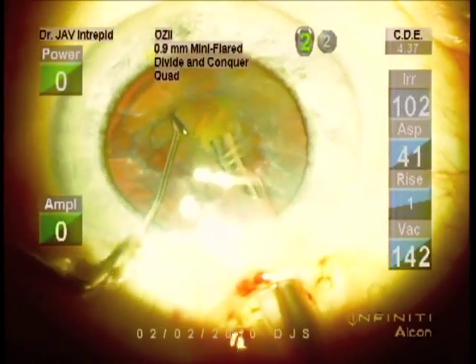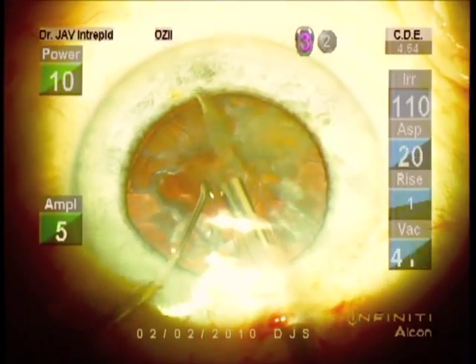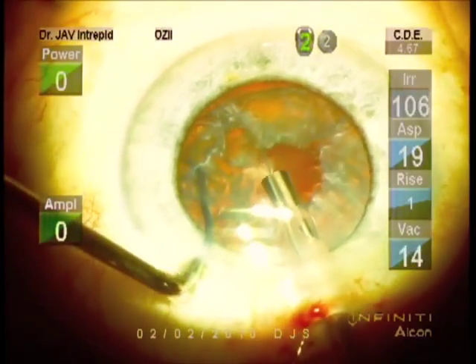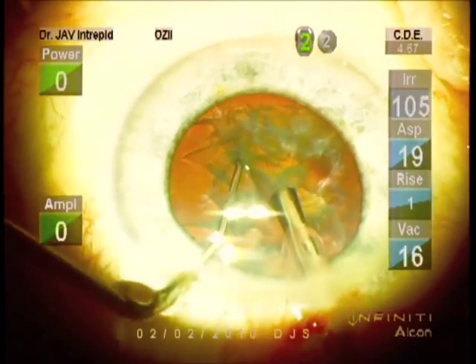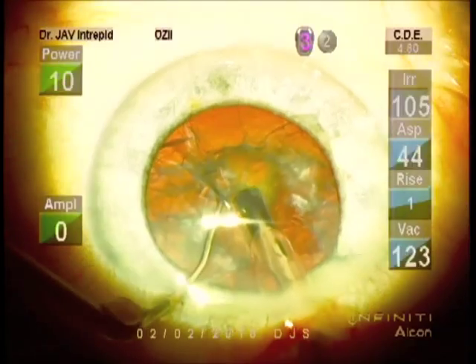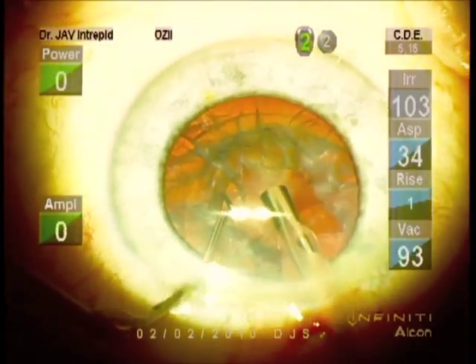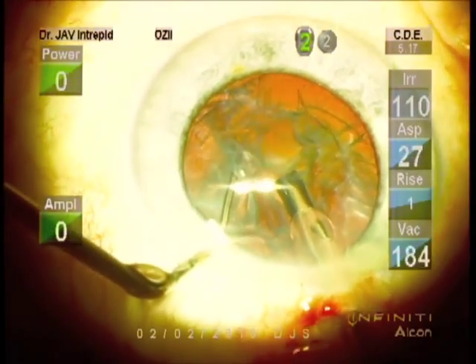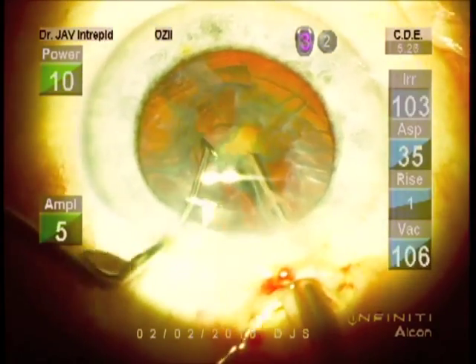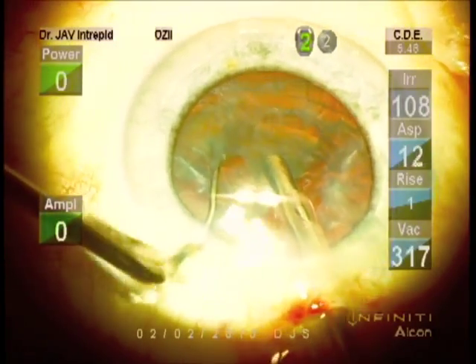If there's an available piece that looks reasonably parallel in size, draw that into the center first, and follow with any adjacent available pieces. Start to rotate. Hydro delineation across these pieces — easy to free up. Sideways motion on the phaco tip to help peel it away. A little bit remains, but very minimal. We've gotten the hard center portion. Sideways motion to peel away, trying to avoid drawing in epi at this point. Continue to concentrate on the central firmer portion of the lens.